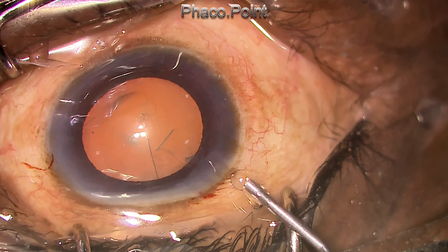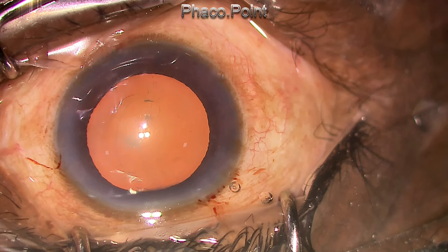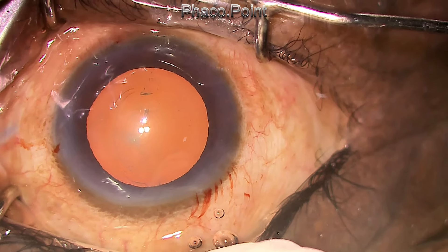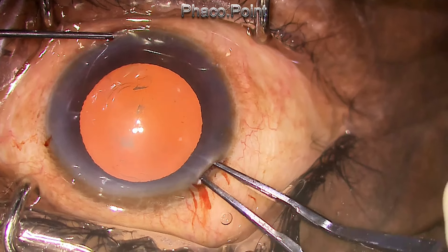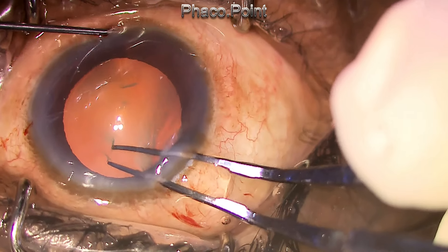The first thing to do is to put in some viscoelastic, roll back the flap, relieve the positive pressure from the anterior chamber by adjusting the speculum if necessary, and then attempt Little's maneuver by holding on to the flap and pulling it inwards in a centripetal fashion.